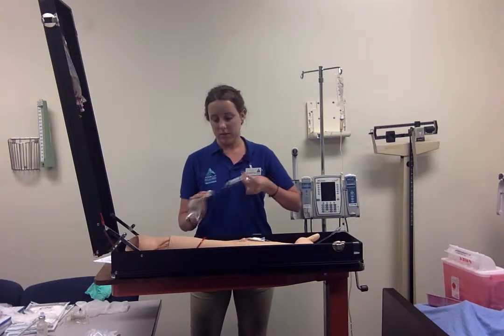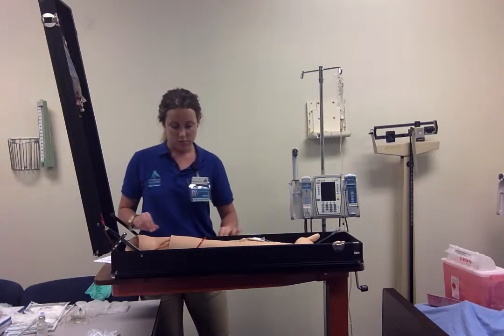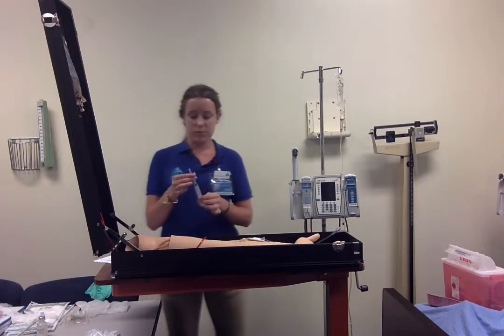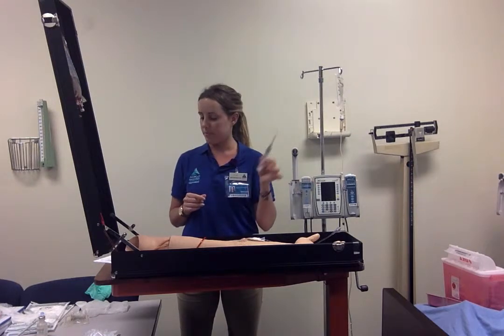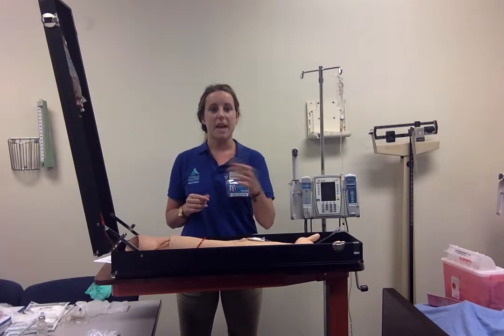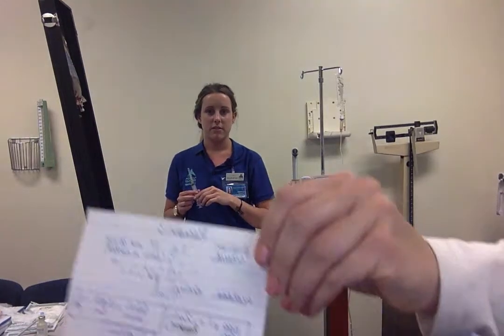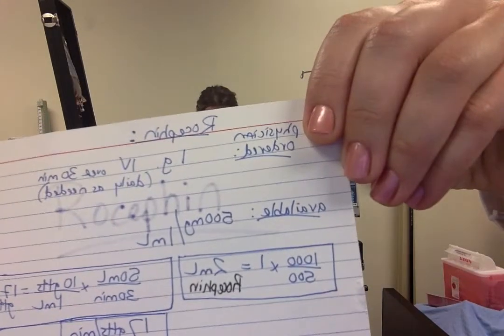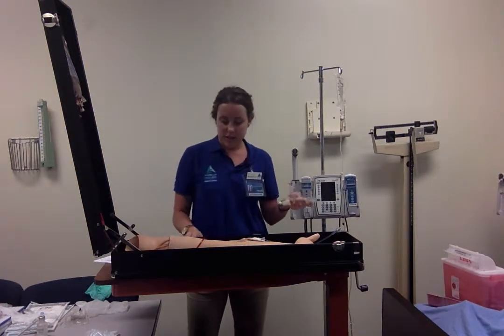Okay, I'm going to take that out and recap. And I do have the card to figure out the drop rate. It's right here. Okay, so the medication is now in the mini bag.